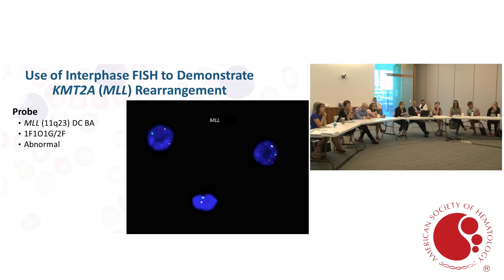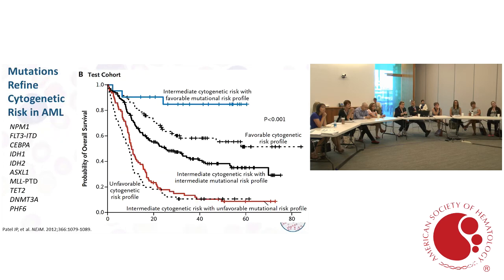And what actually happened in this particular patient is you've created a chromosome where the top of the chromosome is the short arm of chromosome 5, and the bottom of the chromosome is the long arm of chromosome 2. So what ended up happening in this particular patient is you've deleted 5q.